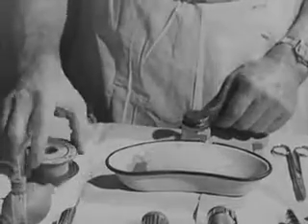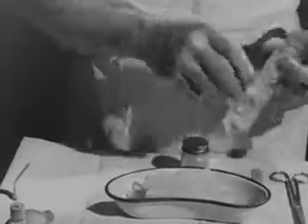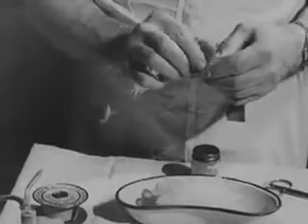You should have handy as well a roll of 1-inch adhesive plaster, and before beginning intubation, prepare a piece for the protection of the teeth during the insertion of the laryngoscope. Cut a strip about 8 inches long and fold it over to 1/3 of its length.